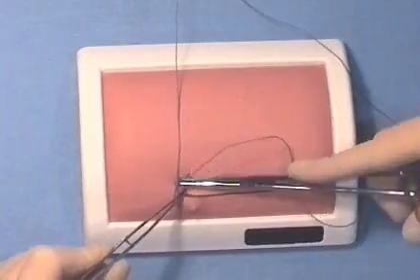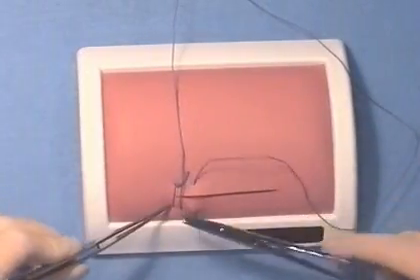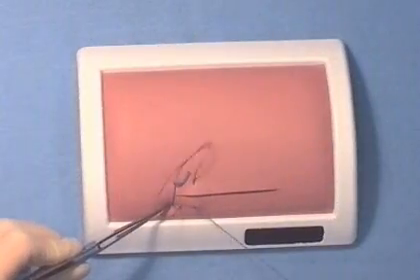The assistant should never pull on the thread when following, but gently hold the suture material away from the incision line.